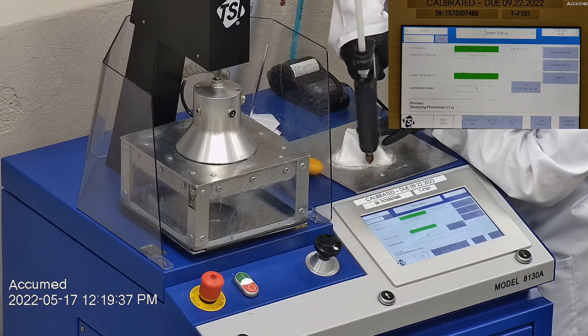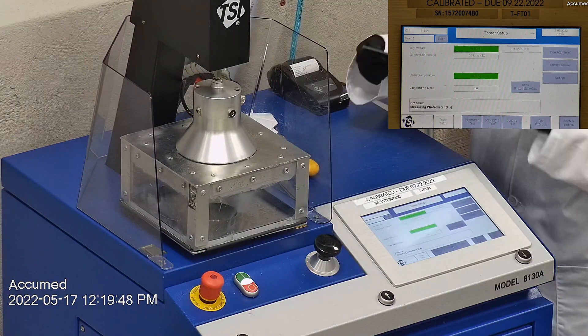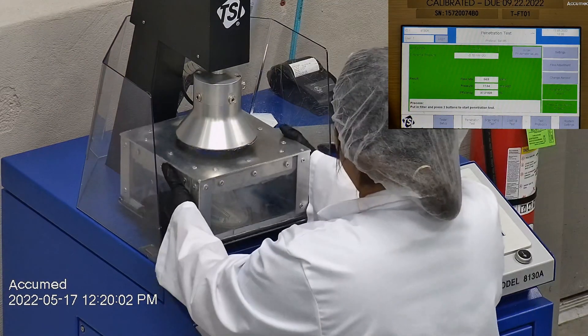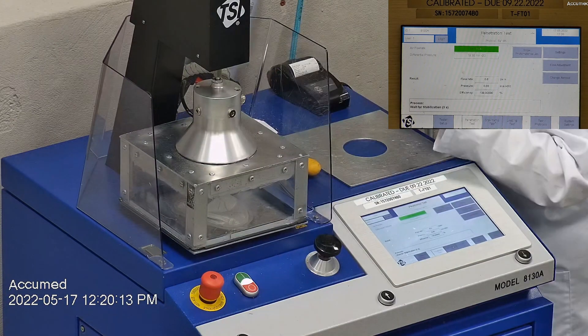F stands for air flow rate, which we test at 85 liters per minute. R is for resistance, also referred to as pressure drop — this correlates with breathability, so the lower the number the more comfortable and breathable the mask is. E stands for filtration efficiency percentage.